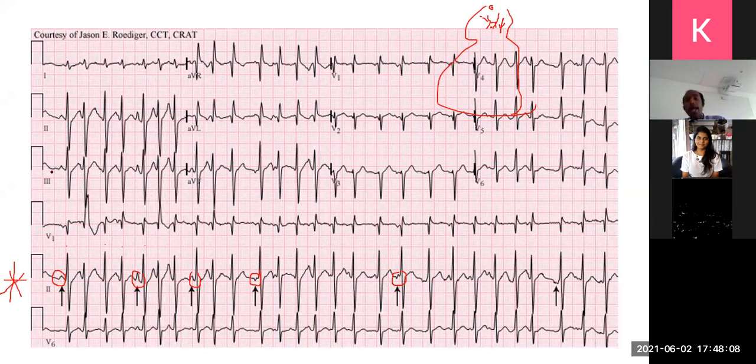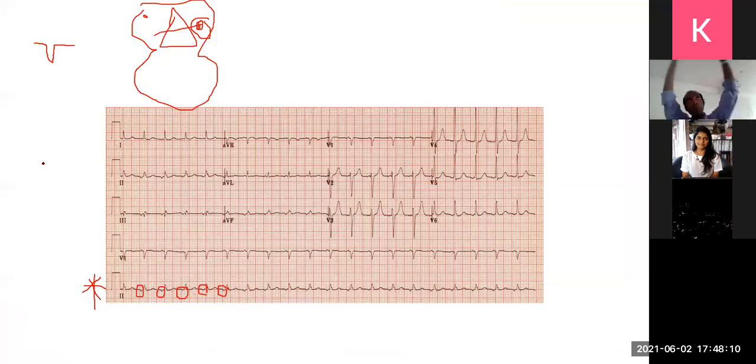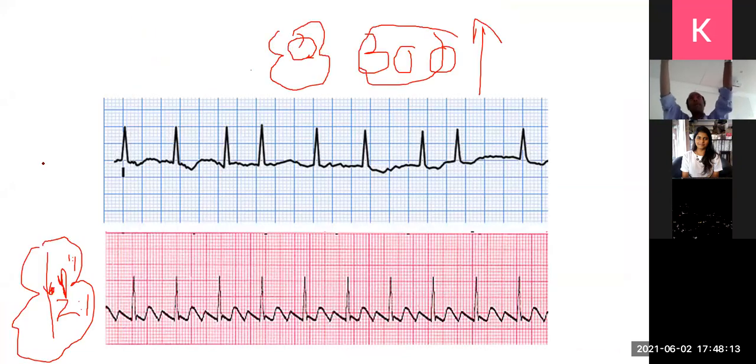Okay? All right. So remember the definition, the overarching principle that applies to all of them: atrial rhythm is abnormal P, normal QRS, normal T. Abnormal P can be thousands and thousands of small pieces in atrial fibrillation, with irregular QRS complexes.